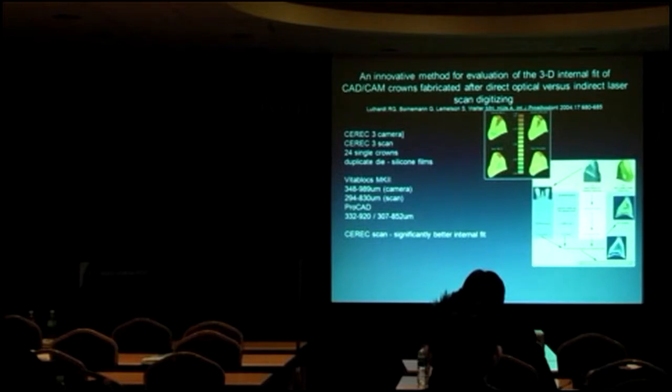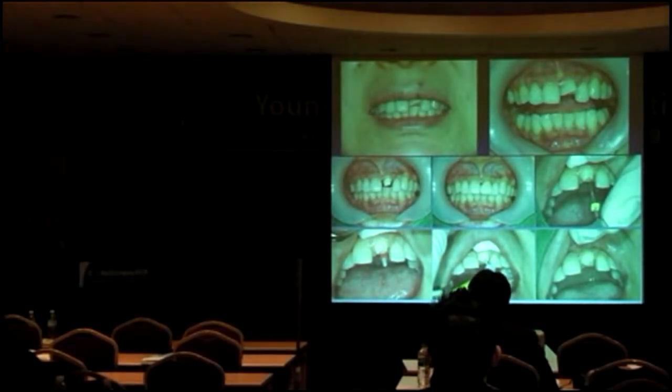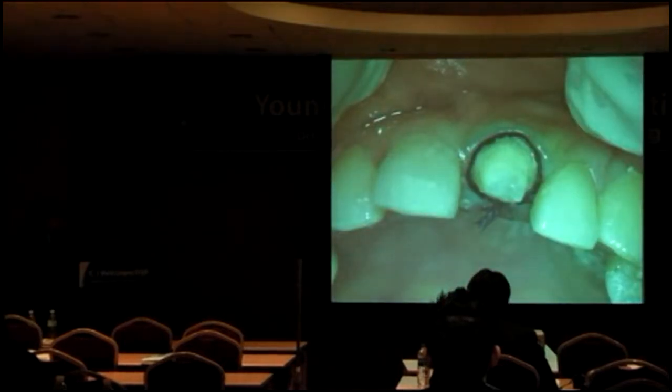So my first question was, how exactly do restorations fit from the digital scan? I asked one of the professors in Korea, and we started a clinical study. There's a single crown case in a natural tooth.